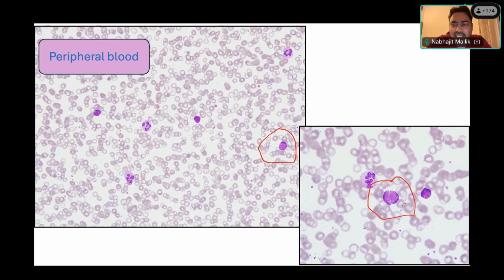Okay, anything else? Jasleen, can you say any other quality of a reactive lymphocyte? The reactive lymphocytes are a little larger with abundant cytoplasm, and you might also see nucleoli. Okay, anything else? What about the cytoplasm? Other than being abundant, any color change? Deeply basophilic. Perfect, right?